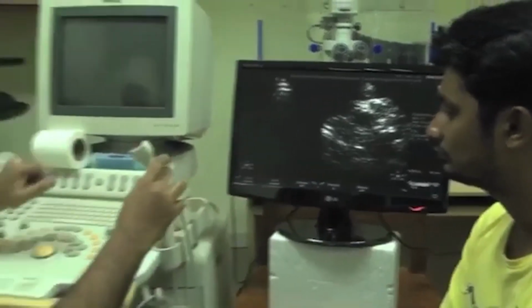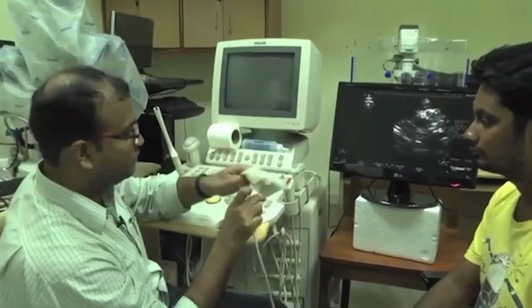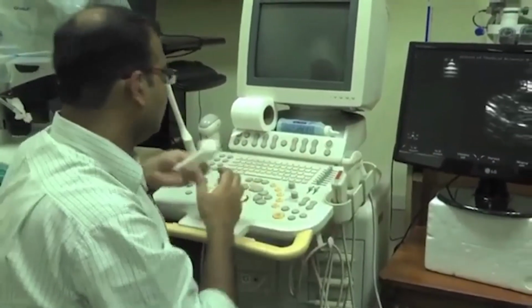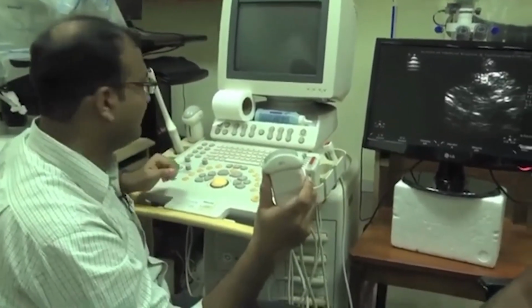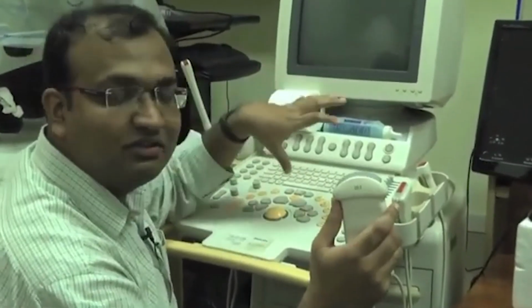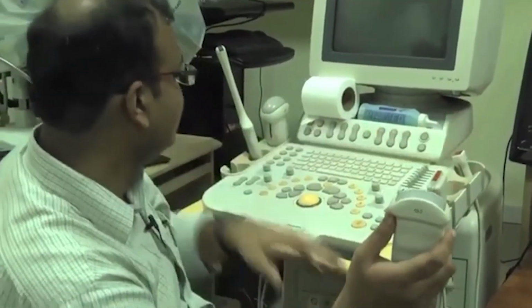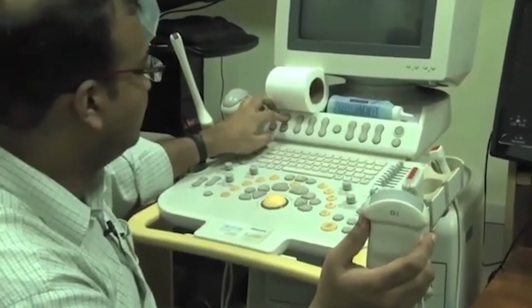Now let's move from one of these probes. As I finish off, I'm going to wipe off the probe as a standard practice and precautionary measure, and next I am going to use this curvilinear probe. For that I will have to do a hard switch within the system, because all my driver circuits, my amplifiers, my power drivers, everything will have to physically switch over to another probe which is electrically connected. So I have my switch over here which is called probe. This is a probe flipping switch.